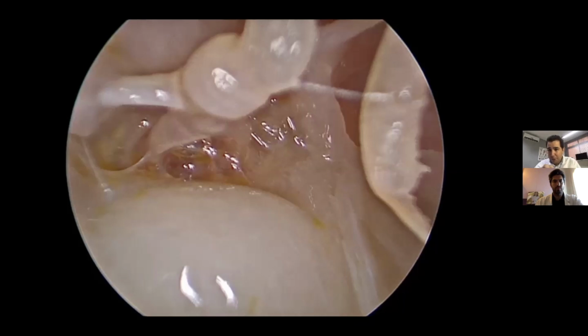So you rely on your knowledge of the anatomy of the facial nerve, or on facial nerve monitoring, which is not very reliable sometimes. During the endoscopic procedure, since we always start through the middle ear, which is the place where the disease actually starts, the second thing we look for is the facial nerve. Finding the facial nerve, even if you need to do a combined approach, gives us a very secure way to do the mastoidectomy, because we already know the position of the facial nerve.